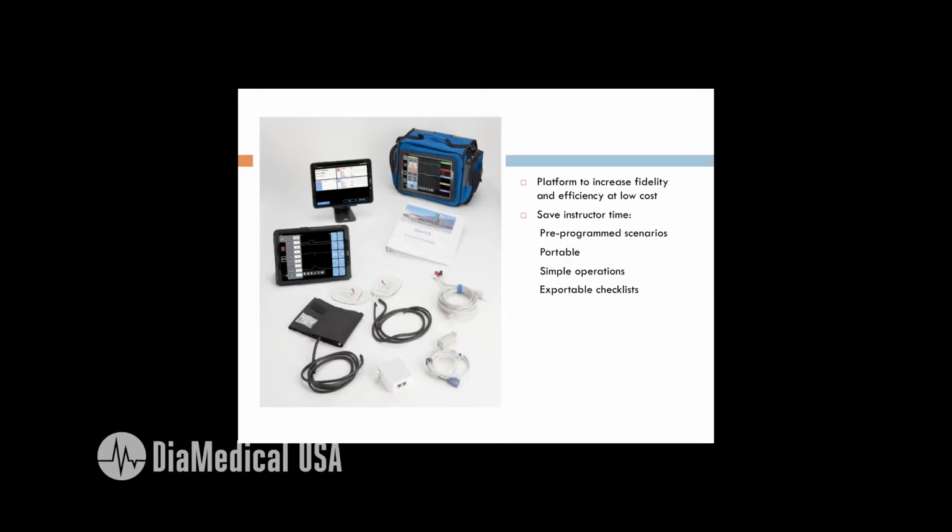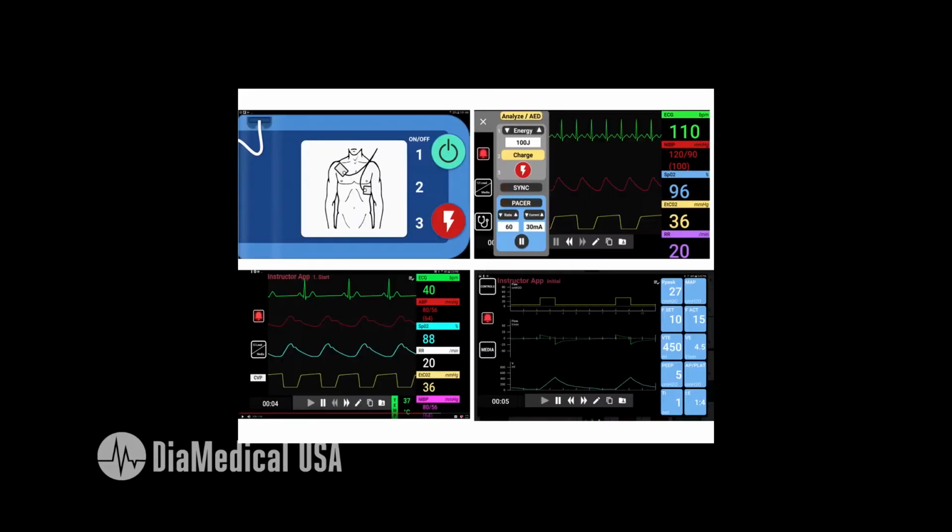For debriefing, the scenario allows you to capture performance while the scenario is playing and export the checklists to be used in debriefing. Let's take a look at some of the other features.